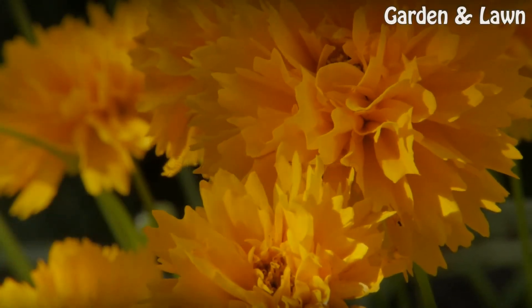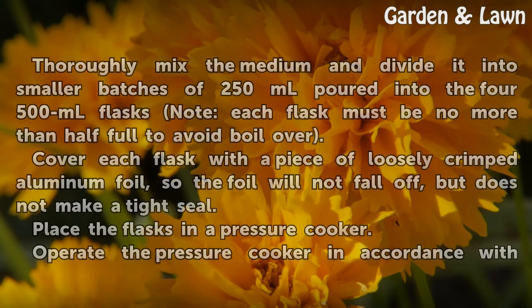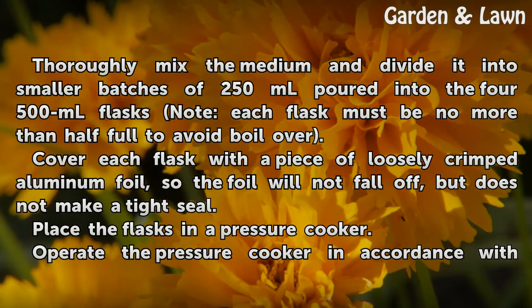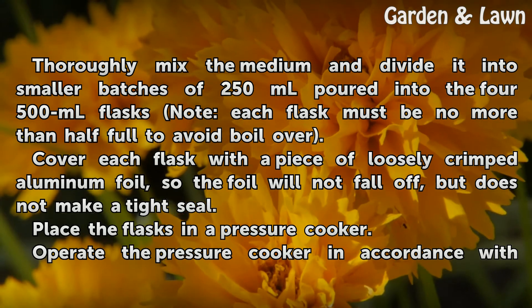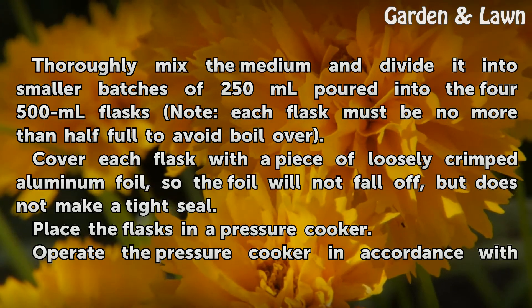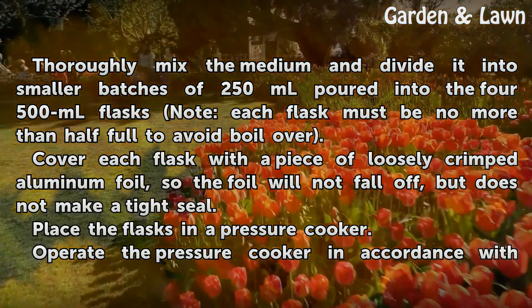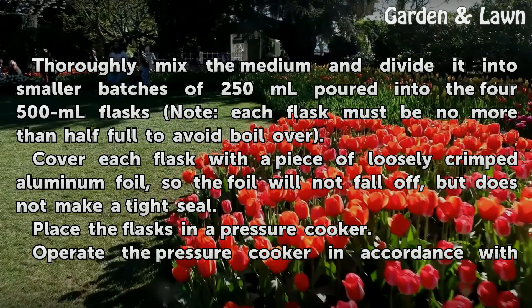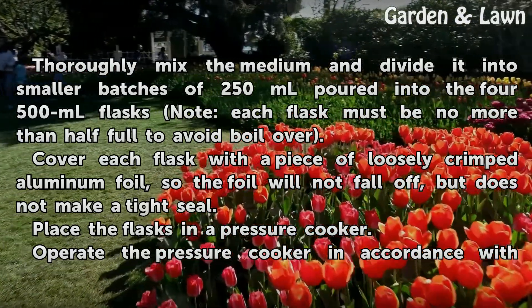Sterilization. Thoroughly mix the medium and divide it into smaller batches of 250ml poured into the 4 x 500ml flasks. Note: each flask must be no more than half full to avoid boil over. Cover each flask with a piece of loosely crimped aluminum foil, so the foil will not fall off but does not make a tight seal.